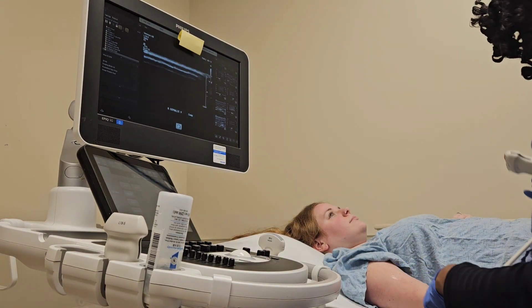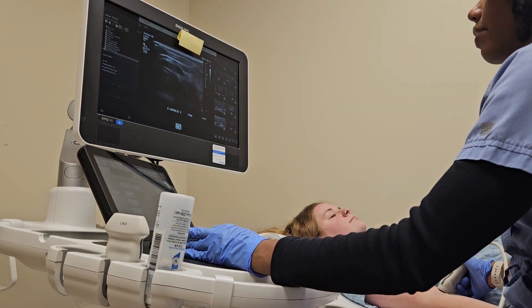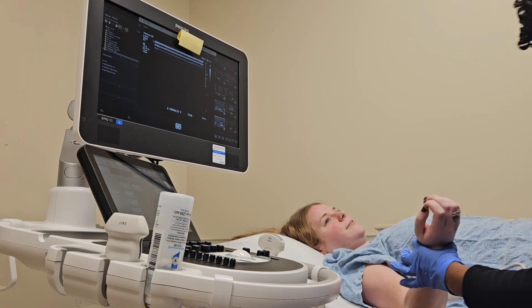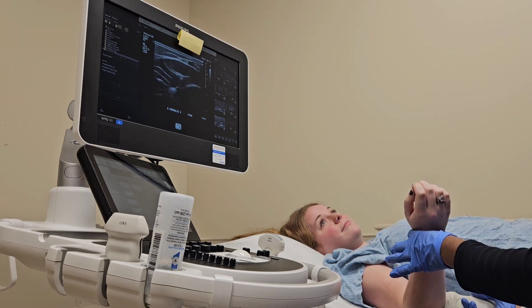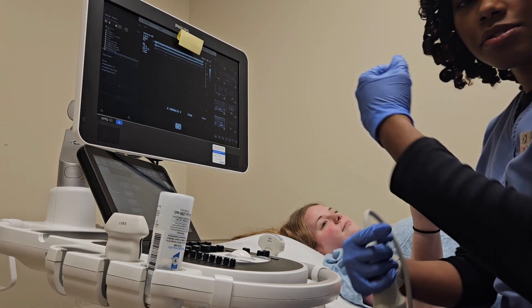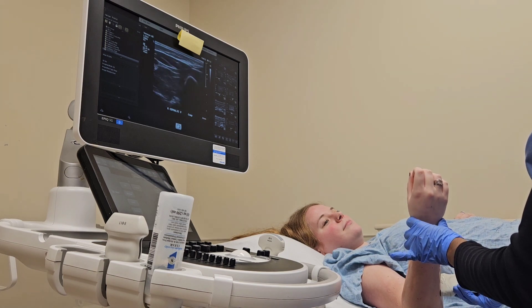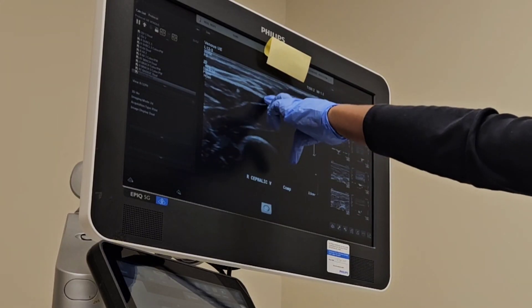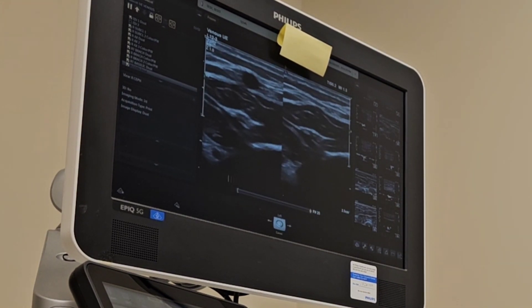We're going to check the inside to see if we can see more of that basilic vein. Sometimes when doing these you have to get in awkward positions just to make sure. I'm going to hold your wrist up and follow this vein — you can see the vein is wrapping around the bottom of her arm, which is the way the basilic vein goes. I'm squeezing really hard on your arm here. It's just hard to compress but we're getting it. As I compress the basilic, you can take more images and label right basilic forearm.